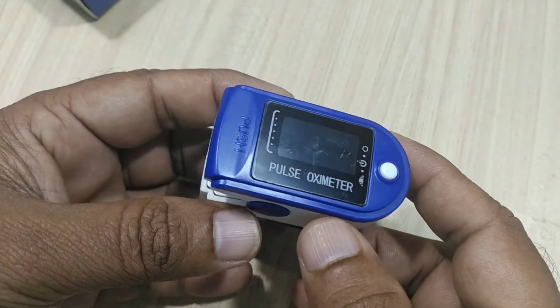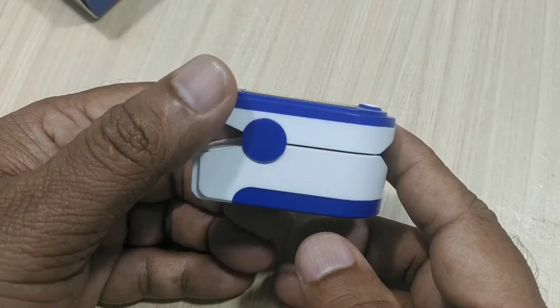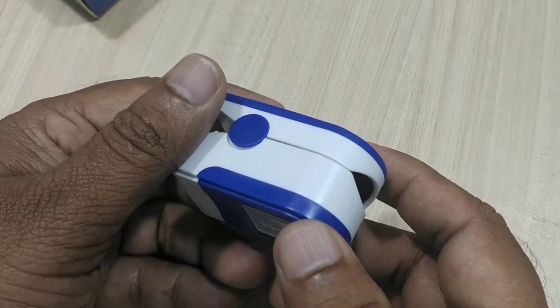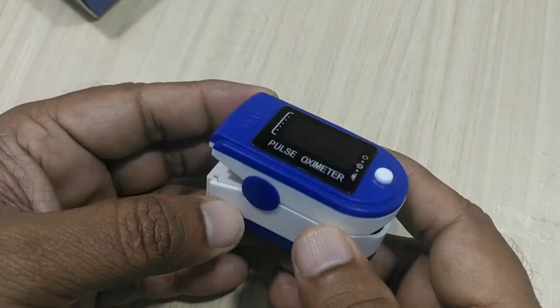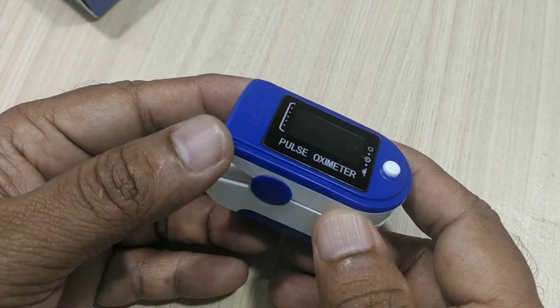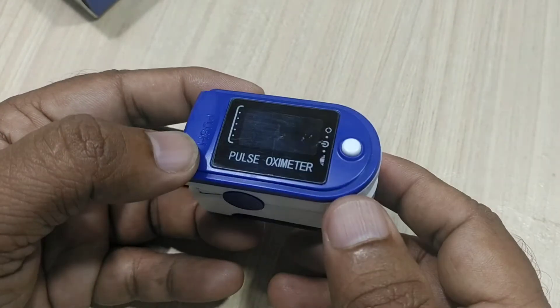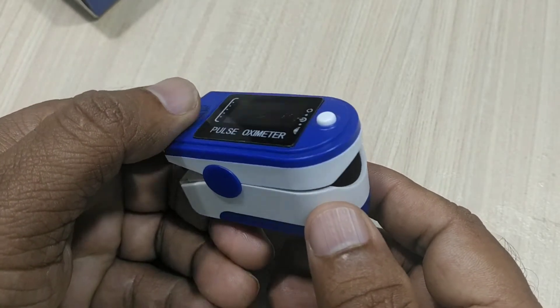A pulse oximeter is generally used for measuring our SpO2, that means our oxygen level in the blood, and the second thing is pulse. Basically these two are measured. The value of SpO2 should be from 95 to 100. If it is below 95, immediately we have to contact the nearby doctor.